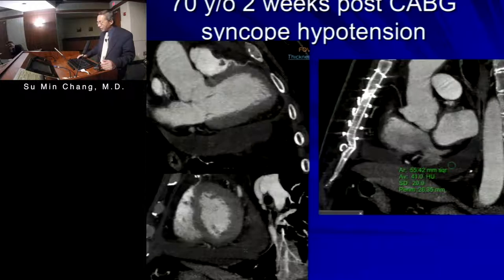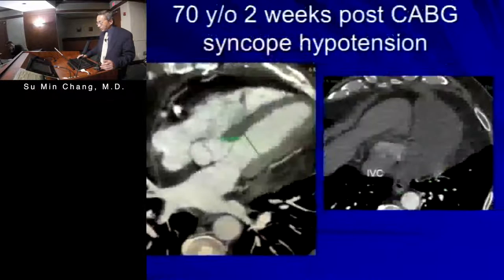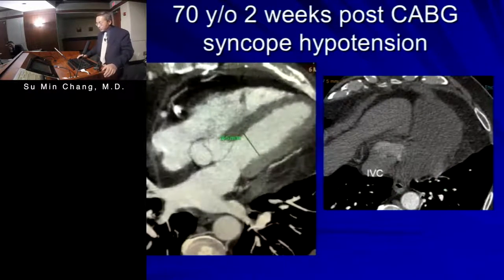As you can see, there's a localized effusion involving the posterior and lateral left ventricle. There's no compromise of the RV, but mostly localized compromise of the LV. As you can see, this is a gentleman who is, I think, at least 6 feet, 220 pounds. You can see the heart is very small, underfilled. The IVC is plethoric, dilated. I think this was useful, again, for surgical planning. And Dr. Lowry reviewed the CT with us to find out the location, so he was able to go in and find exactly where the effusion is and make a window for drainage.